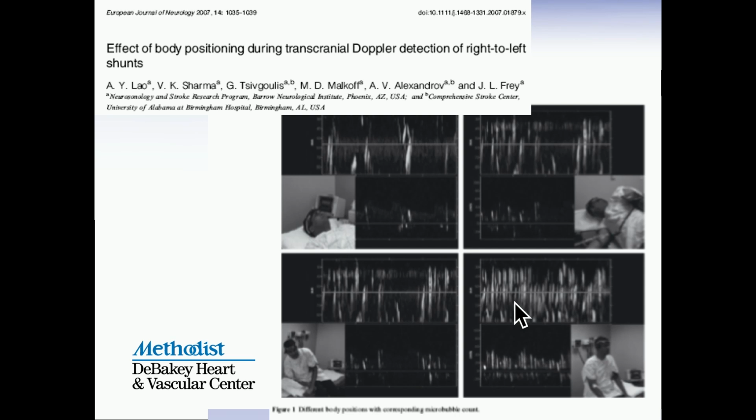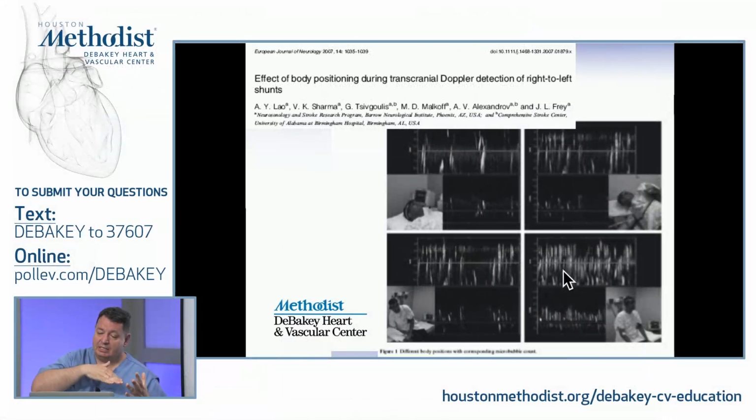Second, when you have a patient having a TEE done, the patient is lying on the left side. That's another funny position, because we're definitely looking for a right to left shunt. You can say that the heart is at a different angle, it's okay. But again, we're looking for a right to left shunt, so the bubbles are not going to go to the left. They will stay on the right more. So you really need to force them with the Valsalva to really open up that connection, I guess.